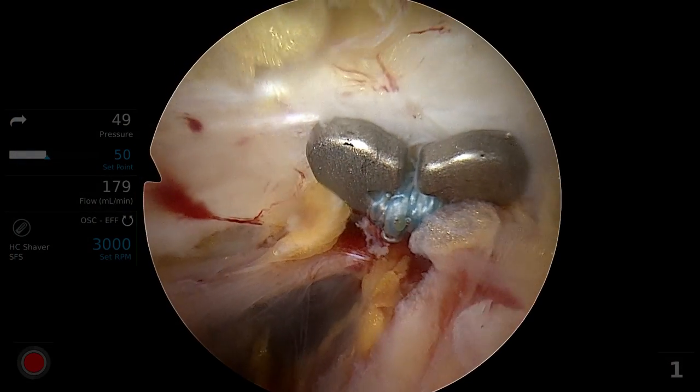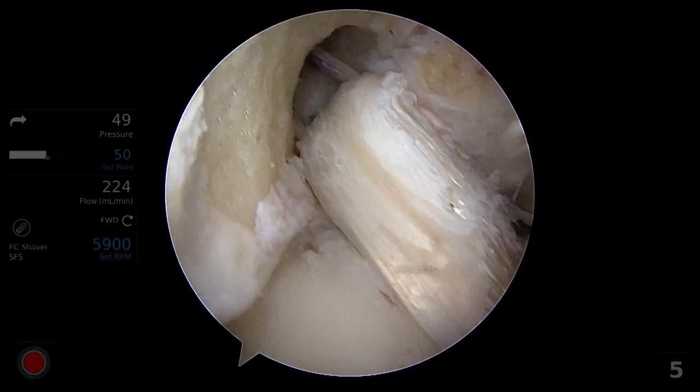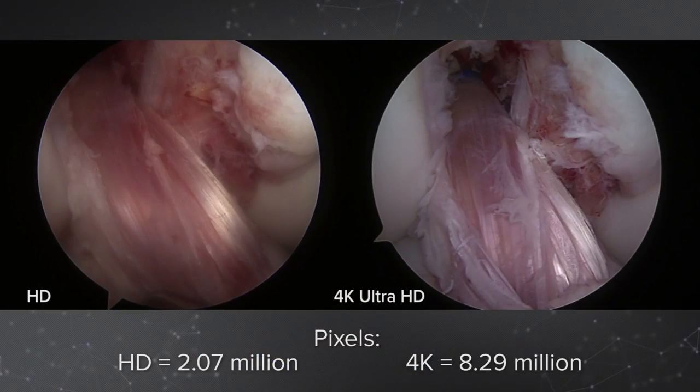The performance difference between the two scopes was measurable. I was surrounded by several seasoned PAs and staff that instantly commented on the improvements in clarity and detail. I was very impressed with the amount of detail I could see with the 4K arthroscope.